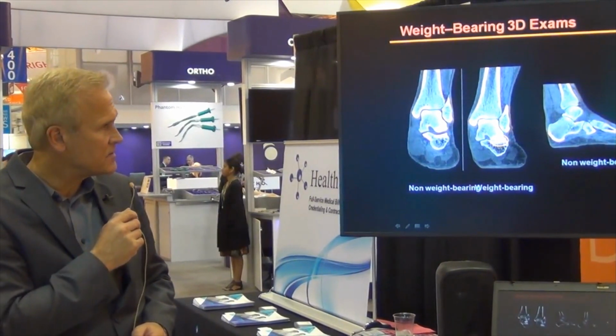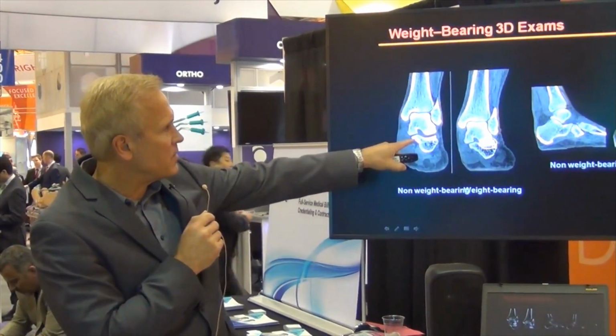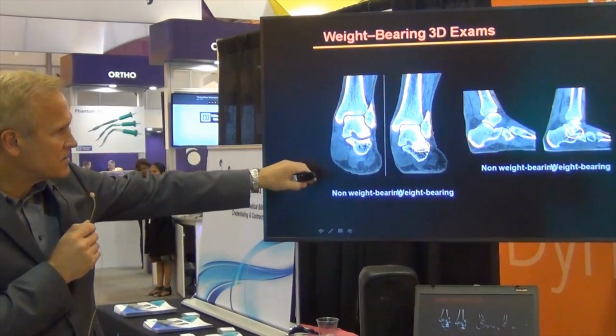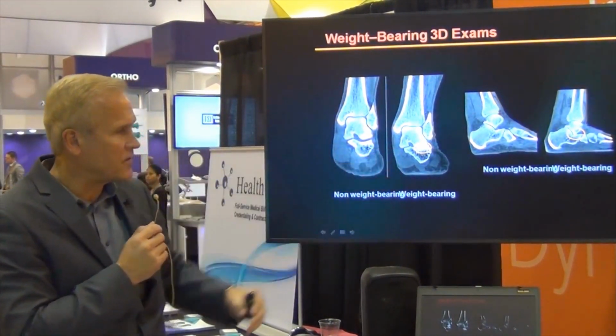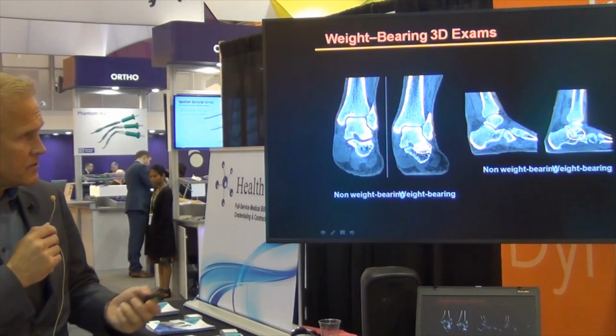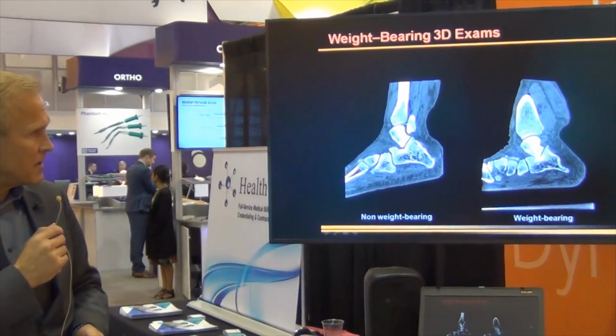So here's a non-weight bearing CT scan and then a weight bearing CT scan. You can see that this looks like there's a lot of cartilage left, but again, the weight bearing, the dynamic test shows that there is no cartilage left in between the two bones. Same thing on the lateral view.